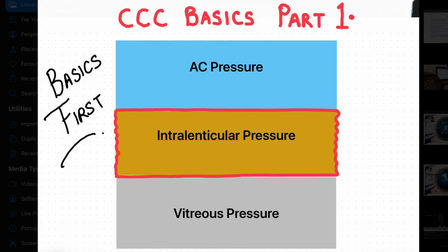Hello. In this educational series featuring all the steps of phaco, after getting a brisk response on my video on how to create amazing sideports, I have decided to take up this topic of continuous curvilinear capsulorhexis, which is one of the most important steps in phaco, in which newcomers and new surgeons struggle a lot.